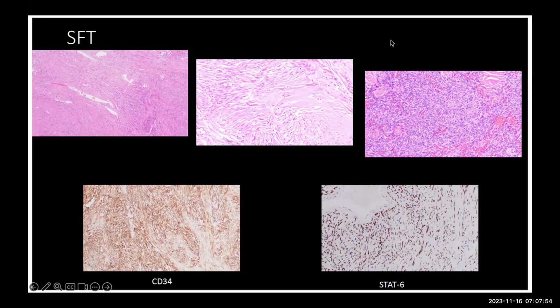And of course, as you see on the top right, there are highly cellular areas as well as low cellular areas. For the pathologist, it's a matter of thinking about the differential diagnosis. As you guys said, meningioma is the typical diagnosis in these cases, but SFT, solitary fibrous tumor, which is what this is, mimics meningioma and some other mesenchymal tumors.